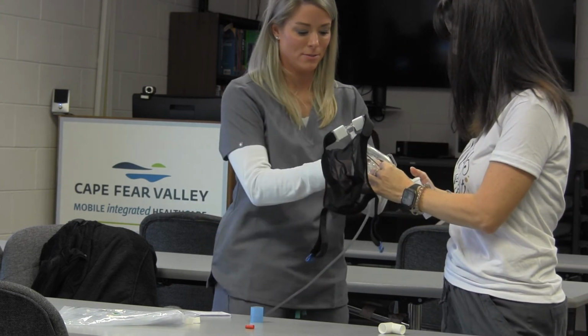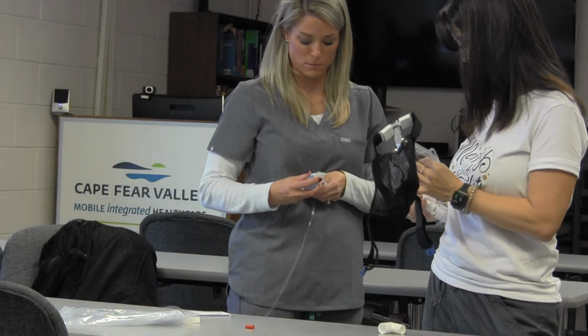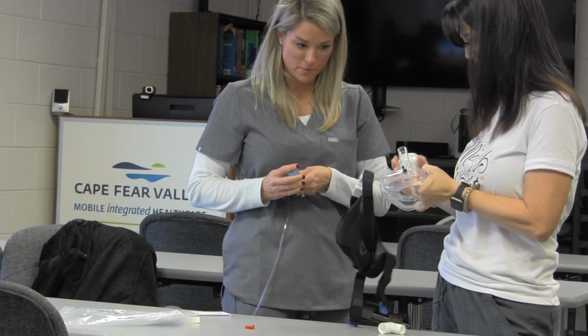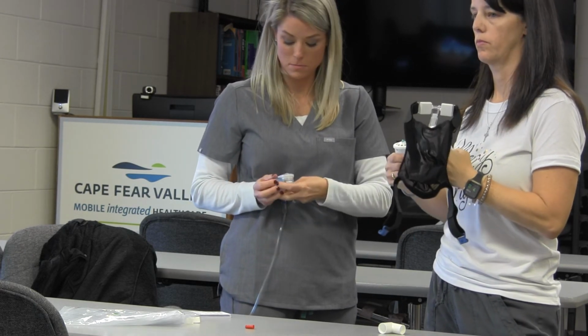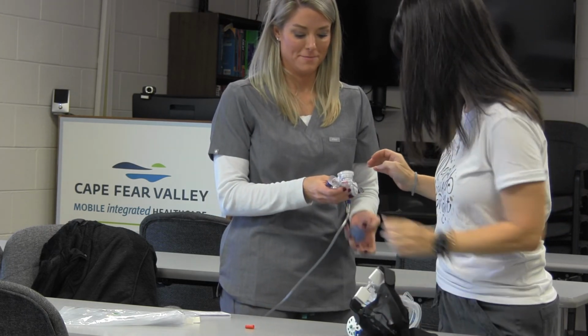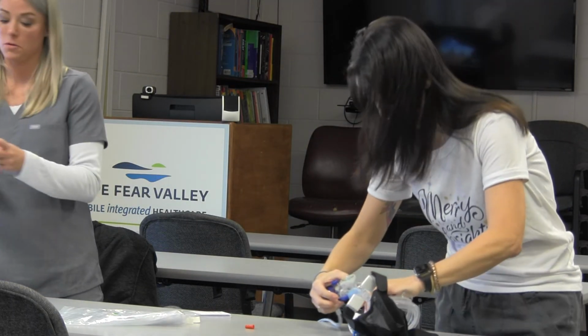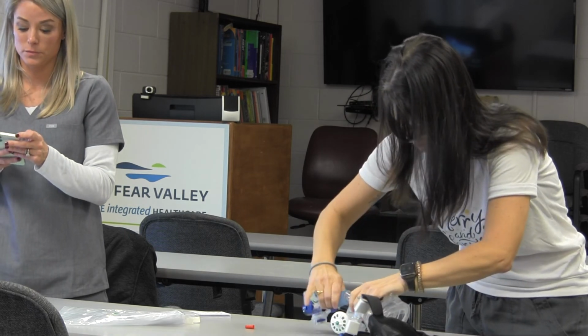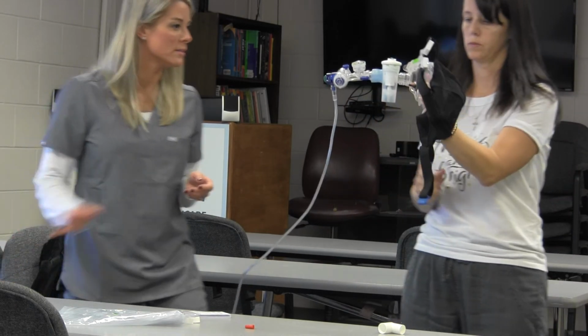I was gonna say, do the blue to the... Is that going down? It's a good thing we're not treating a patient. I'm not sure that works. Let me see, I know we have a part number, but that doesn't help, they don't have it here. There you go. All you need is the T and the blue piece. That's it.